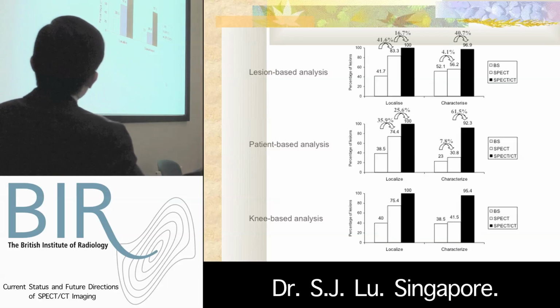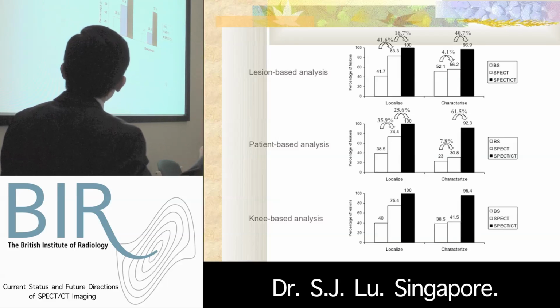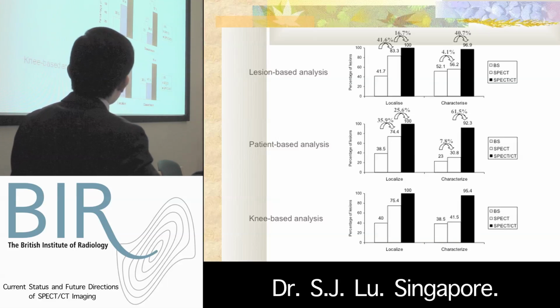The same trend can be observed in the patient-based analysis. Numbers are different, but the pattern is the same. Knee-based analysis as well, same pattern of incremental value of SPECT-CT.